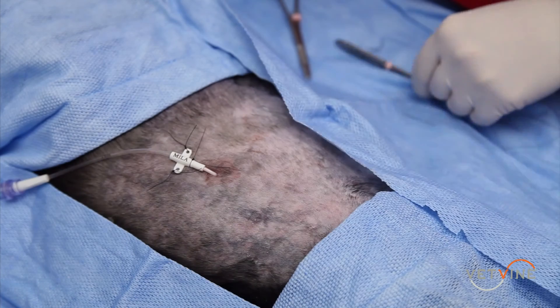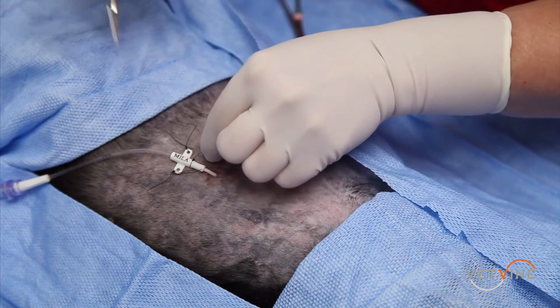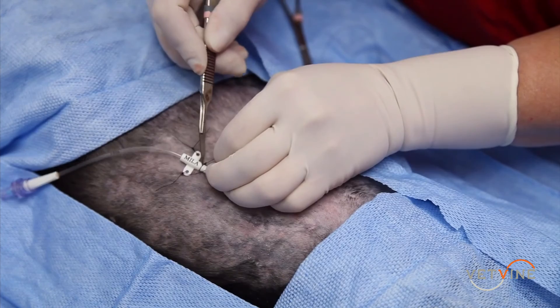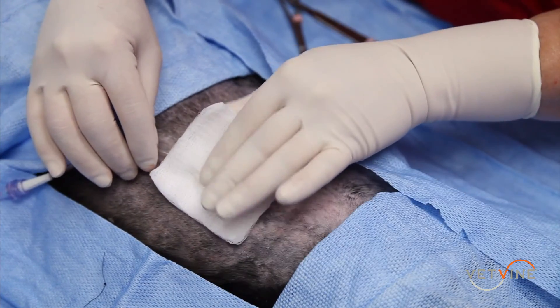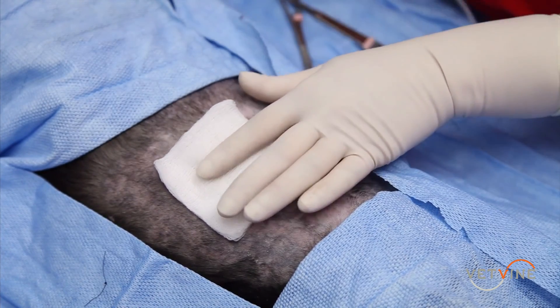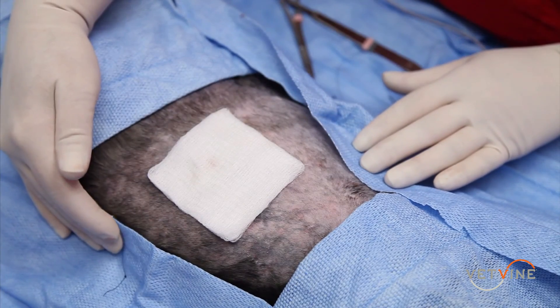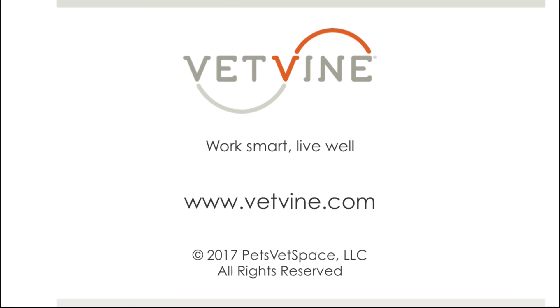To remove the tube, the sutures can simply be cut, a light gauze placed over the entrance site, and the tube pulled. A light bandage can then be placed over the site for 24 hours.